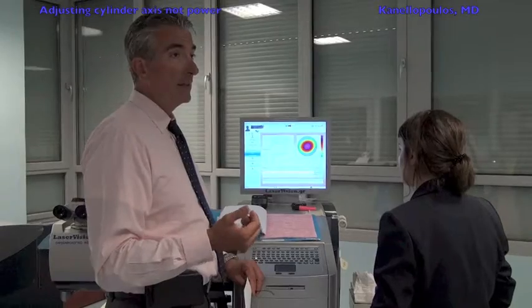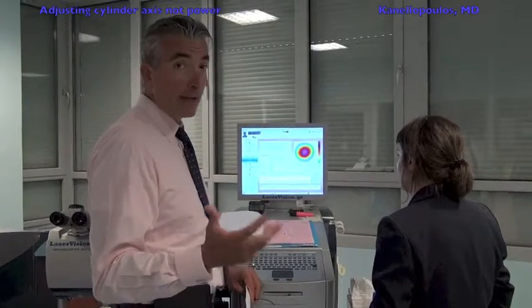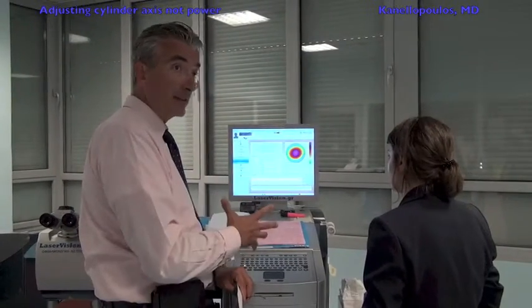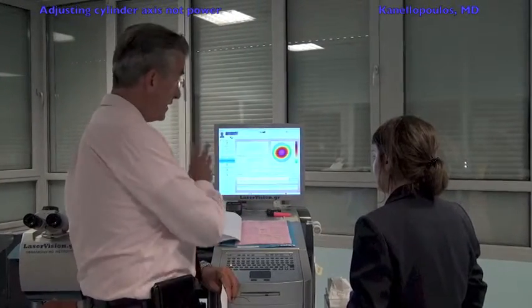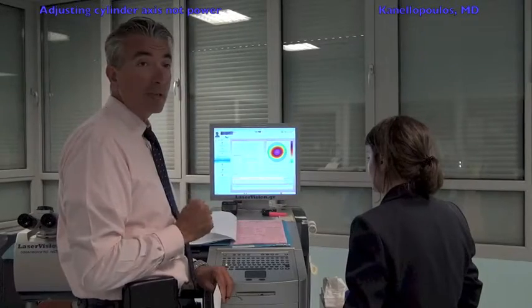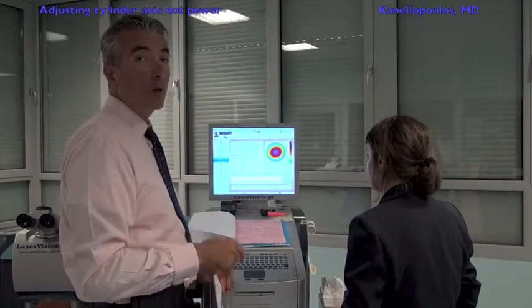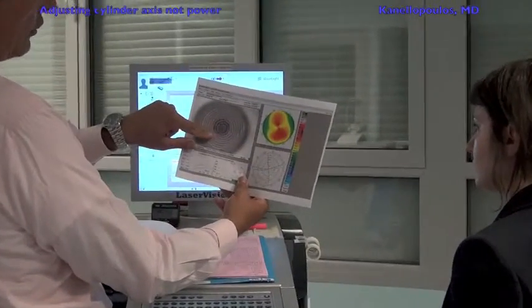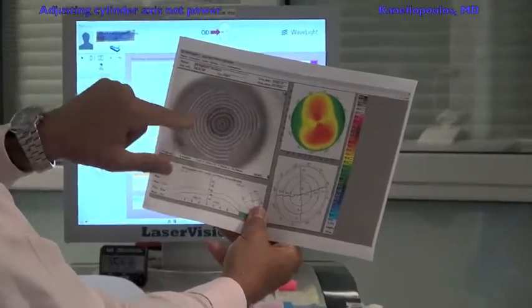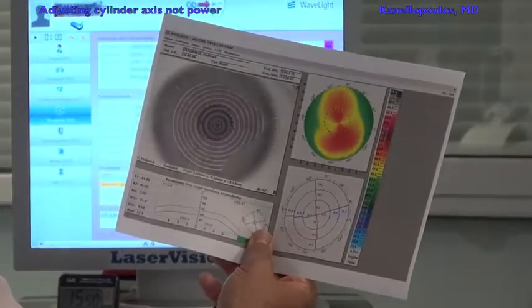that patient. And we'll talk a little bit about why it is that the refractive cylinder and the placido-derived topography data may not be similar in all patients. And we can see on this placido topography that it has some angle kappa. The pupillary aperture does not coincide with the cornea apex.